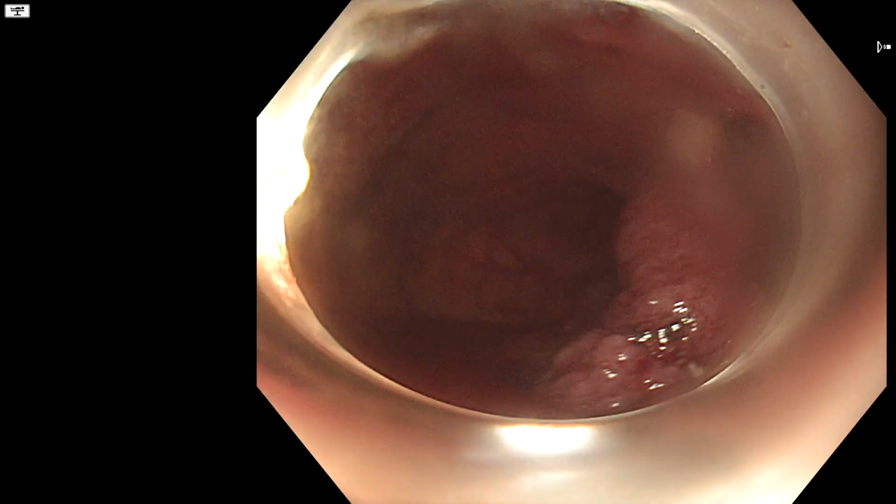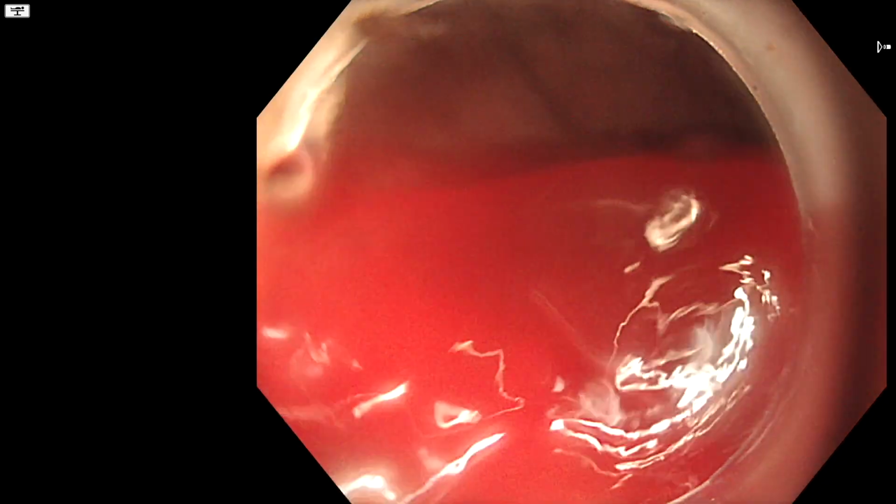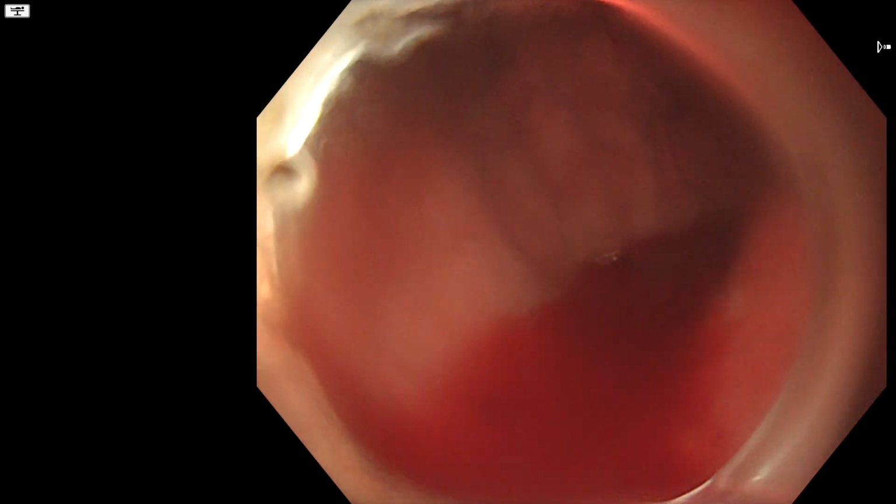So I need to take the chance to suction some of the blood that's pooling, and we're quickly moving the patient onto his back.